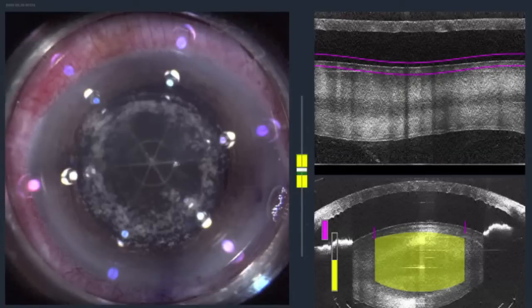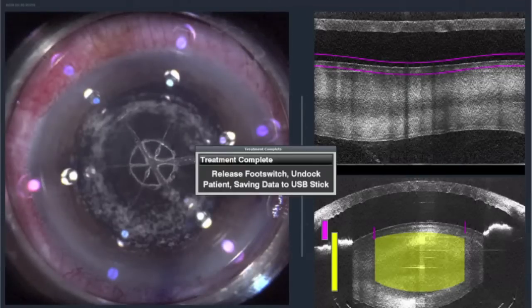And the laser is firing from down to up so the air bubbles can escape. There is hardly any discomfort to the patient, and as you see, the eye is very steady. Now the process is complete and laser tells us to release the suction mechanism.